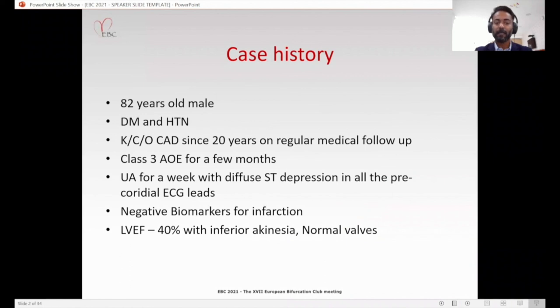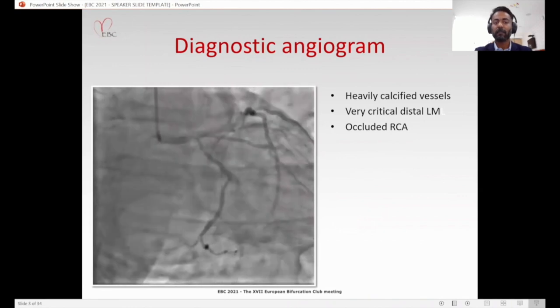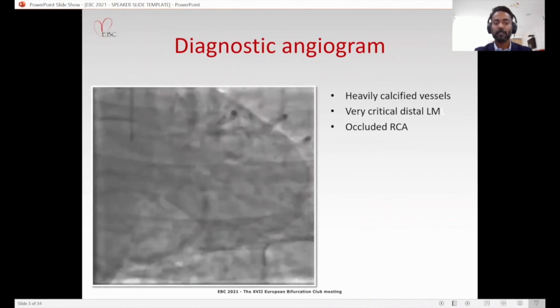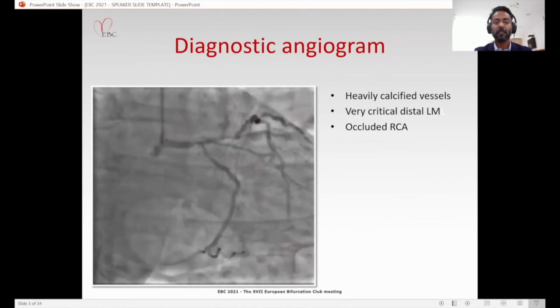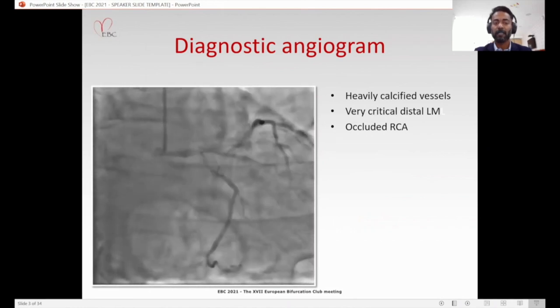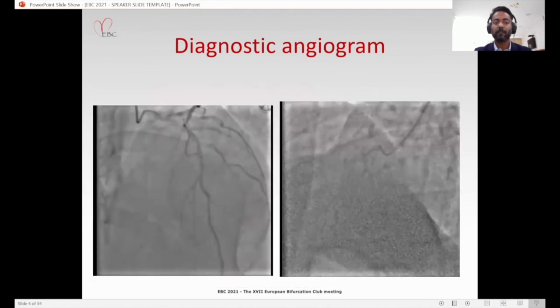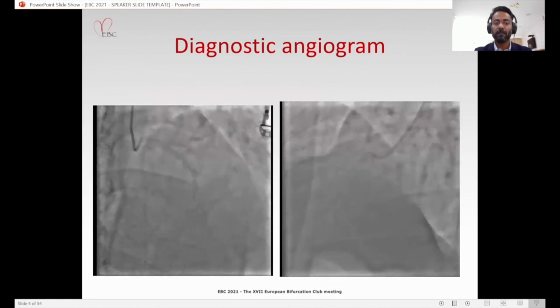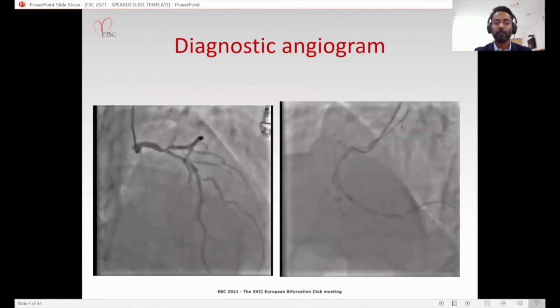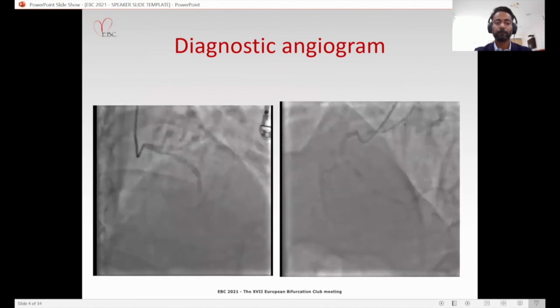He had negative biomarkers for myocardial infarction and had an ejection fraction of 40% with inferior akinesia and normal valves. On the diagnostic angiogram, we found diffuse triple vessel disease with a critical distal left main lesion. His coronary arteries were heavily calcified, and there was long segment disease in the LAD and the circumflex. As we can appreciate in the cranial projection, the LAD was diffusely diseased, heavily calcified, and was also giving some collaterals to the right coronary artery, which was diffusely diseased with an occluded PDA.